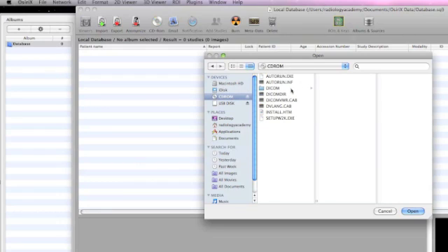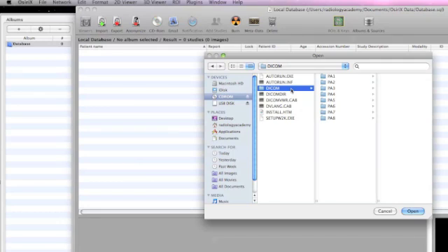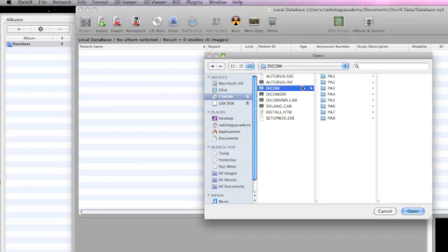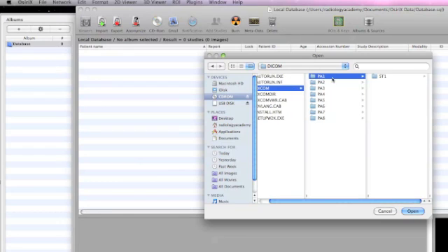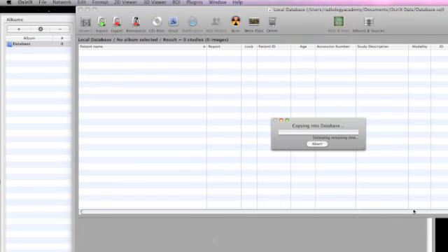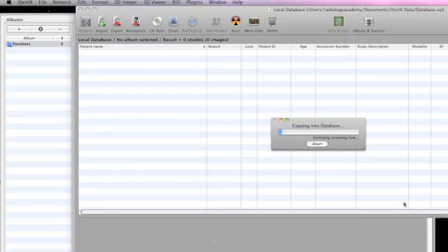Within this, we will see a DICOM folder, though the pattern of files will vary according to the source. We can import from any different level. This DICOM folder has a number of patient examinations - patients one, two, three, etc. If at this point we select to open the DICOM file, it will import all of those patients. But if we identify PA1, patient one, it will identify that patient alone. Or we can go any step further to the individual series if needs be. Those films will be imported into the database and can be aborted at any point if any mistake has been made during importation.